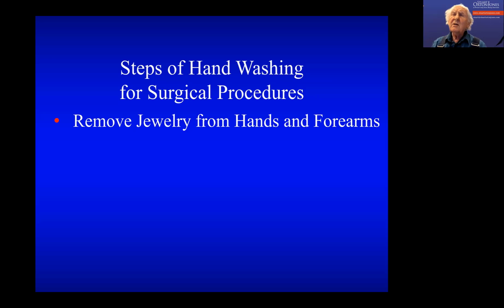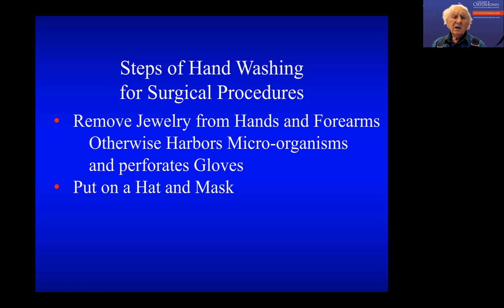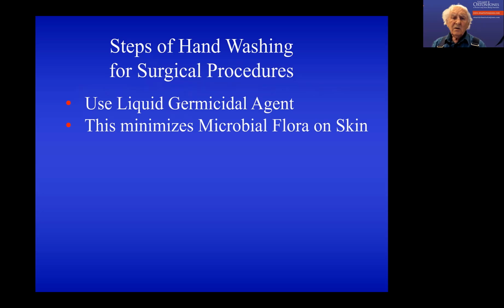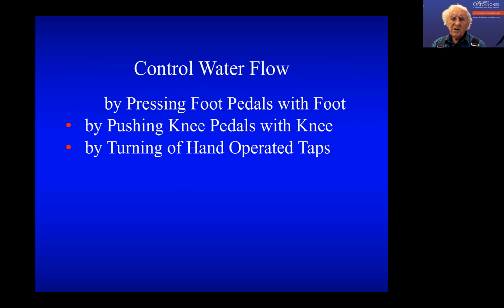I don't believe you need to go through this if you're removing teeth, or even wisdom teeth. Anyway, the first thing you do is to take your jewelry off, because these can harbor bacteria and they can perforate gloves. You put on a hat. This is fairly routine now, so I'm going fast through it.